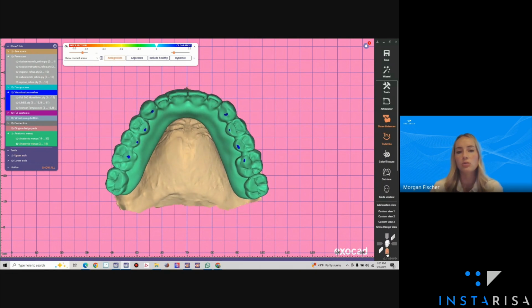So after I do my 12 o'clock analysis, next I'm going to look at my occlusal analysis. With an InstaRisa's design, we prefer lingualized occlusion, bilateral simultaneous contact with lingualized occlusion with 7 through 10 out of contact and no contact on the last molar. On the day of surgery, you can expect no cantilevers. On your final prosthetic, you can expect no cantilevers longer than 10 millimeters.